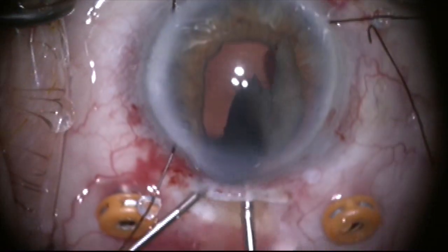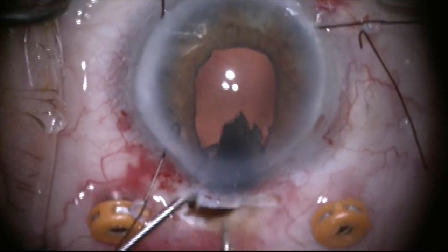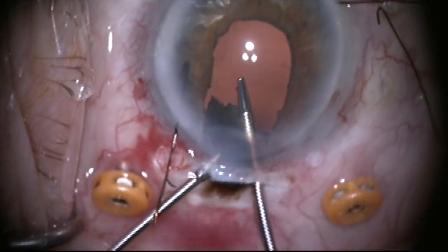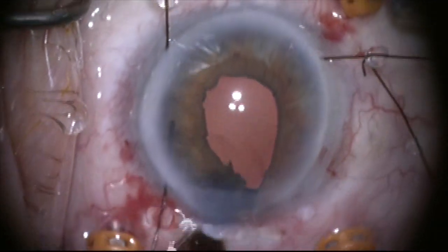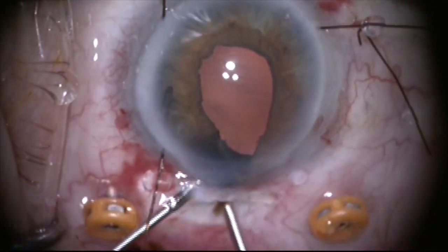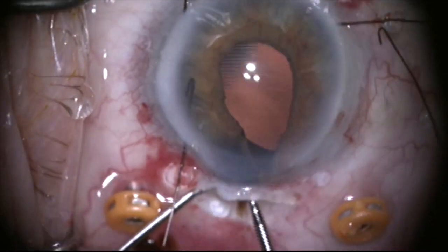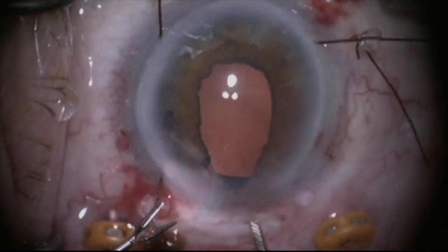I'm going to try to grab this, burp it, express it, use fluid to push it out — this is really dark, dense, hard-looking lens material. I'm massaging it out through the 6mm incision trying to keep the iris from coming out, and I'm able to get this piece out, but there's still a really big chunk in the back of the eye.